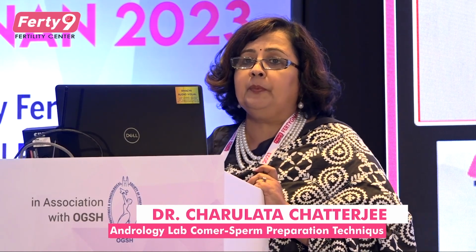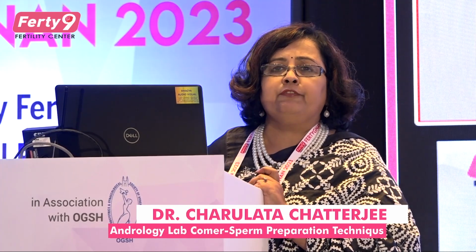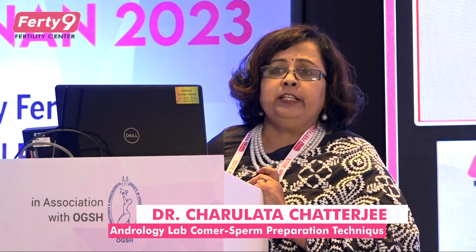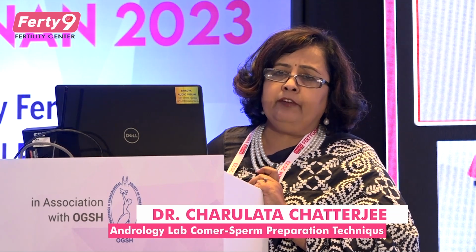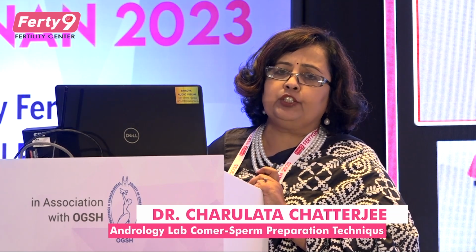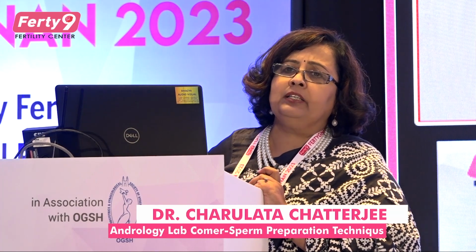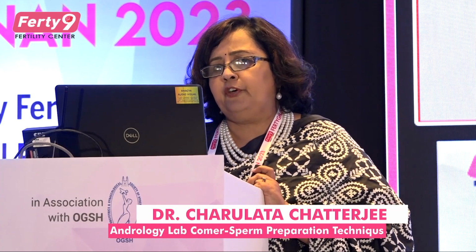Now the most popular method is the swim up method. What we do here is, if the sperm count is normal, meaning normozoospermia, we mix with the sperm preparation media, we centrifuge them at a definite RPM, that is rotations per minute, and the supernatant is discarded. The sediment is overlaid with the sperm nutrient media, and the best motile spermatozoa will swim up, and that can be used for IUI, IVF or ICSI procedure.